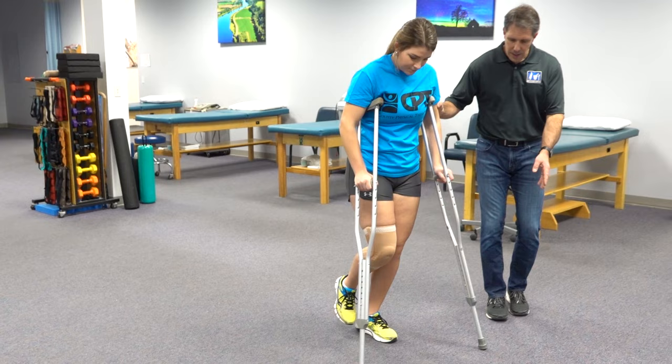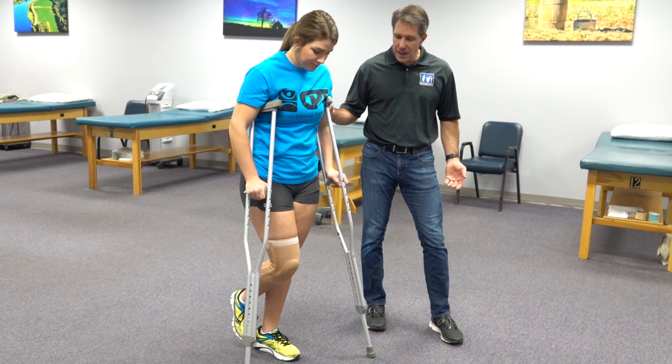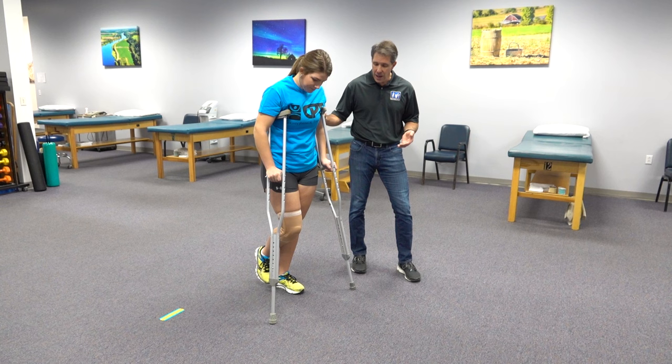Now once you have practiced that and you are feeling comfortable, then you can get into a swing-through type of posturing or gait when you use your crutches. We are going to demonstrate that next.